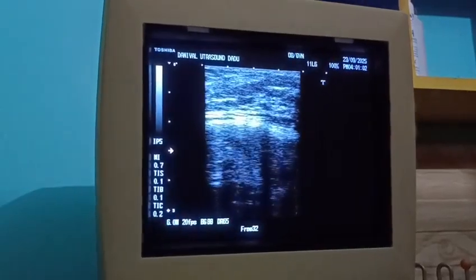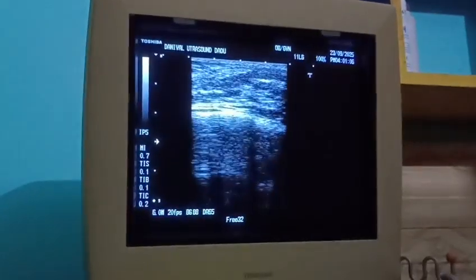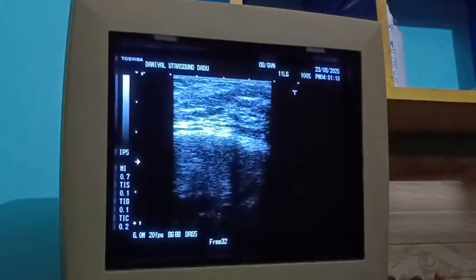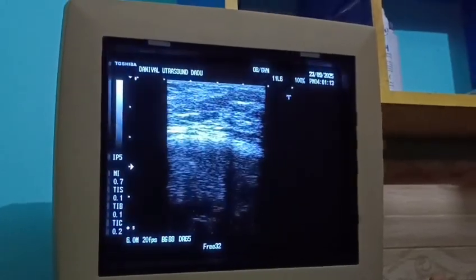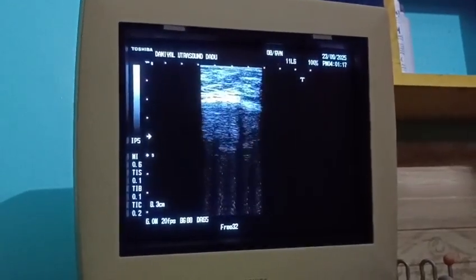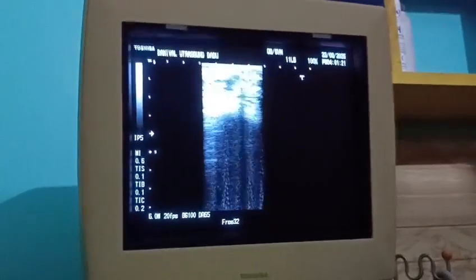The sixth and last layer is the ribs and pleura. Ribs are rounded hypoechoic structures, as you know. They've got an echogenic rim and cast posterior acoustic shadows, and the pleural line is a bright echogenic line deep to the ribs, moving with respiration. Let me show you that. This last line is quite darker here, but this is the pleural line.